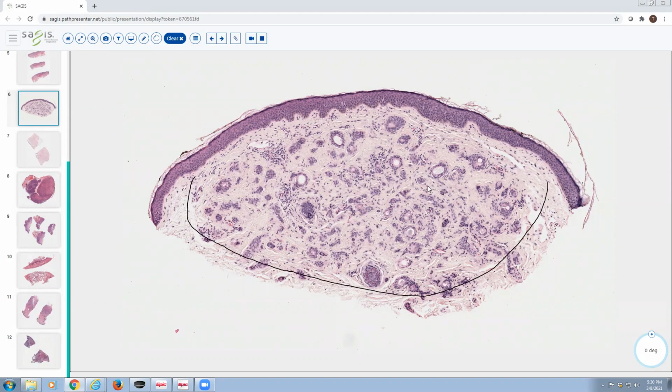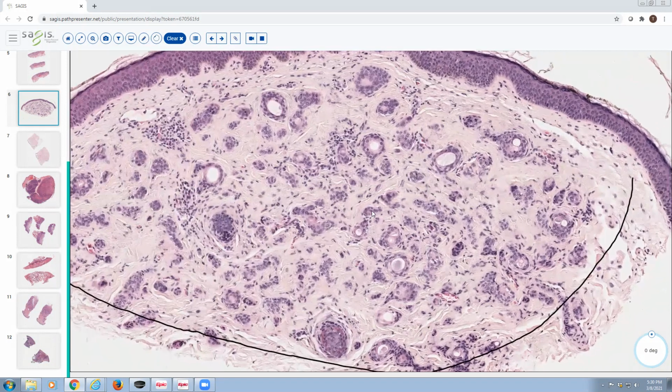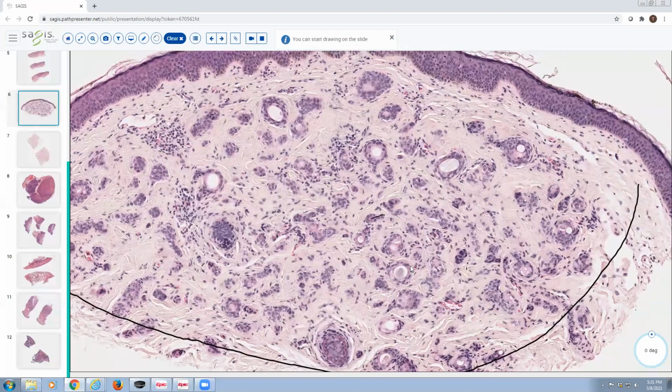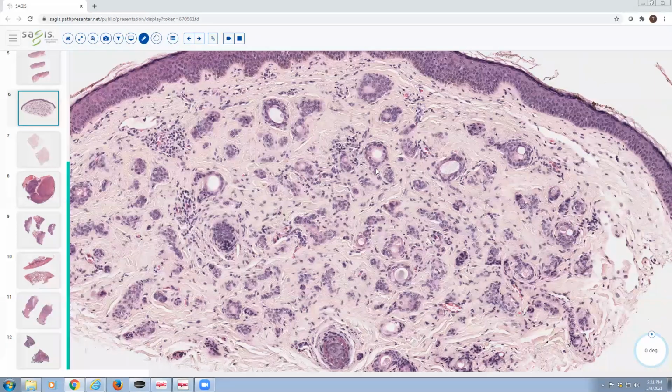The neoplasm in this case is epithelial, and I would describe these epithelial cells as arranged not only as strands, but also as ducts. So this is the most salient feature here, recognizing that we have ducts situated in the dermis. And many of those ducts have a little tail of epithelium that comes off from the side. So they're shaped kind of like commas, and you've got this little tail of epithelium to the side. So this is a syringoma, and these ducts represent eccrine sweat glands.